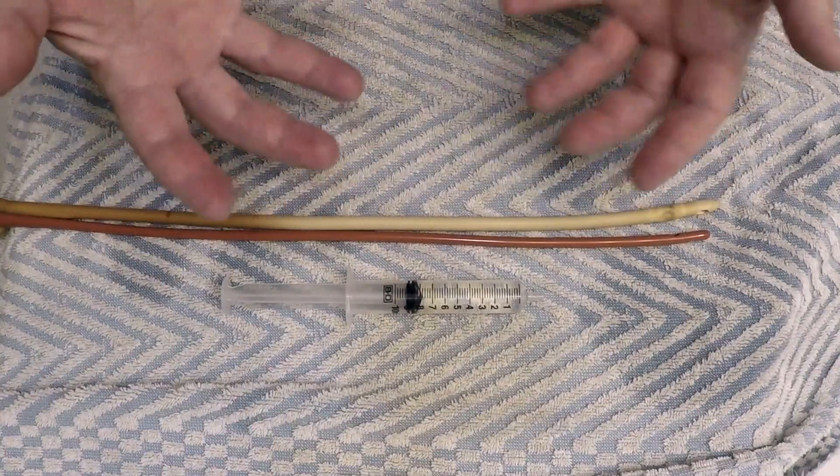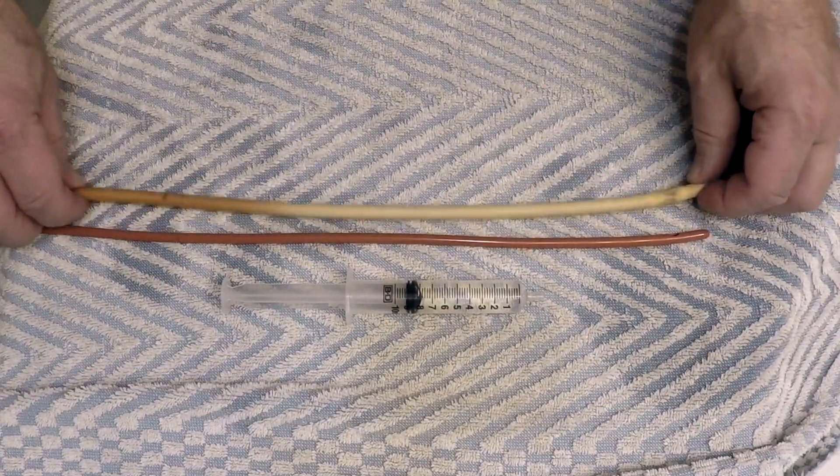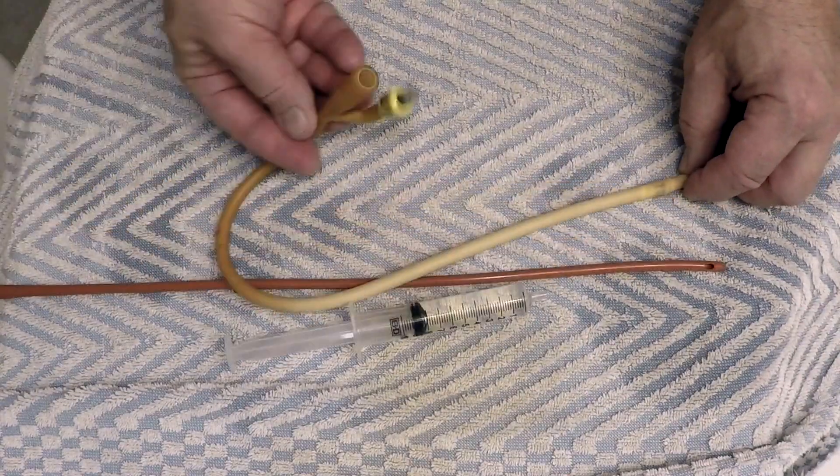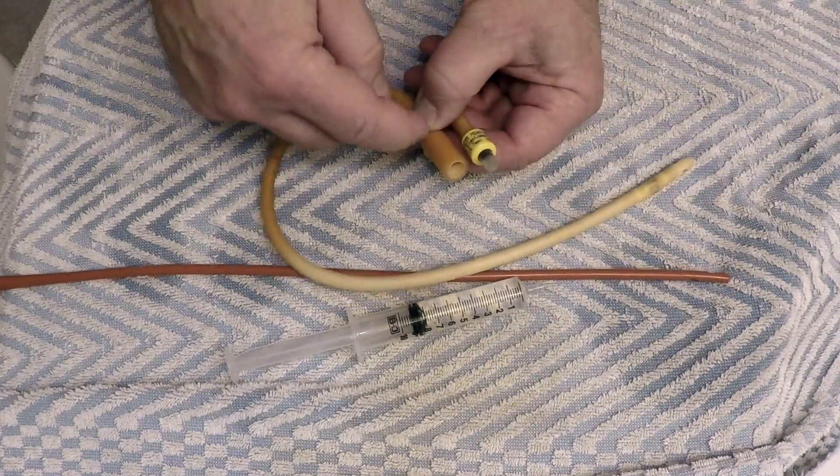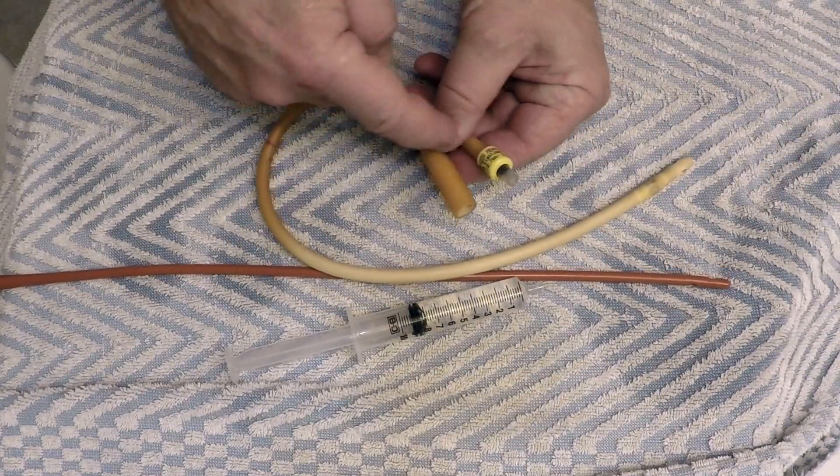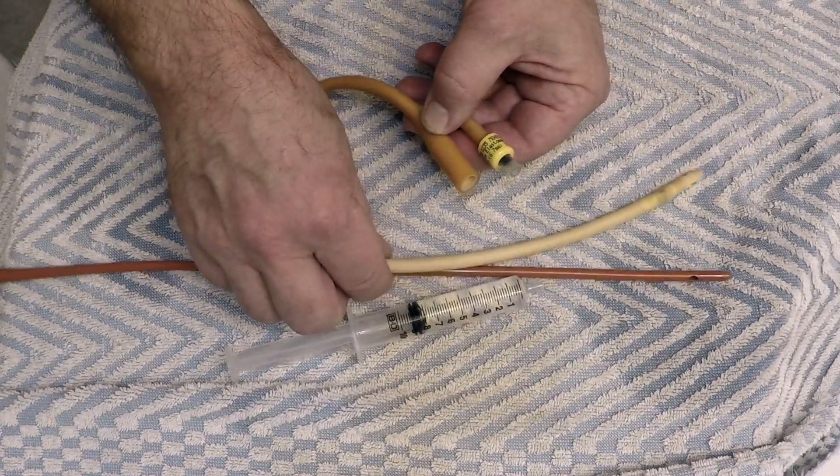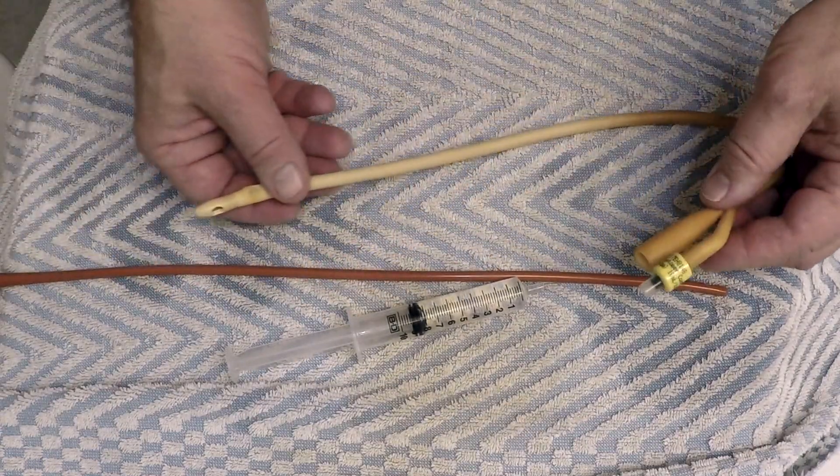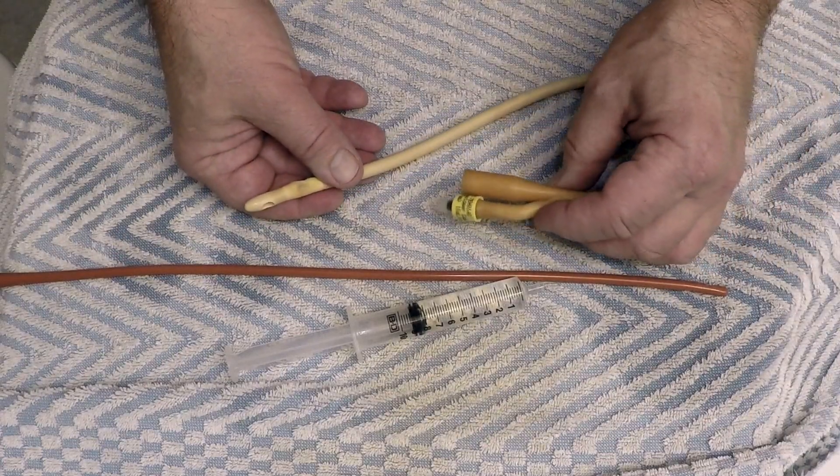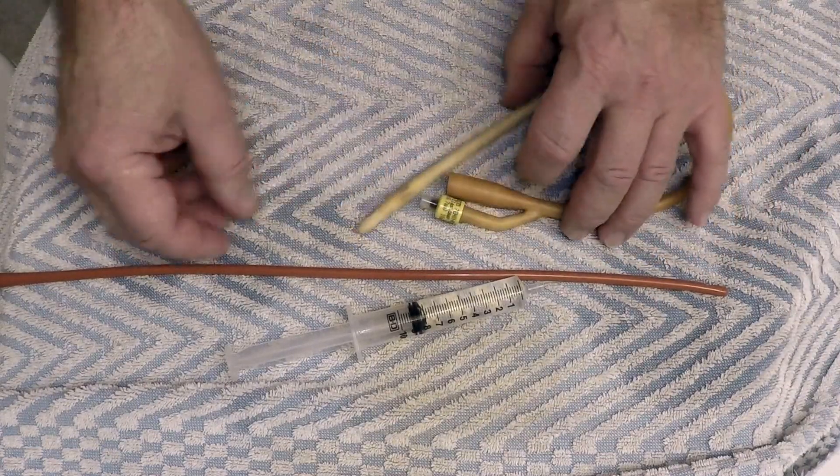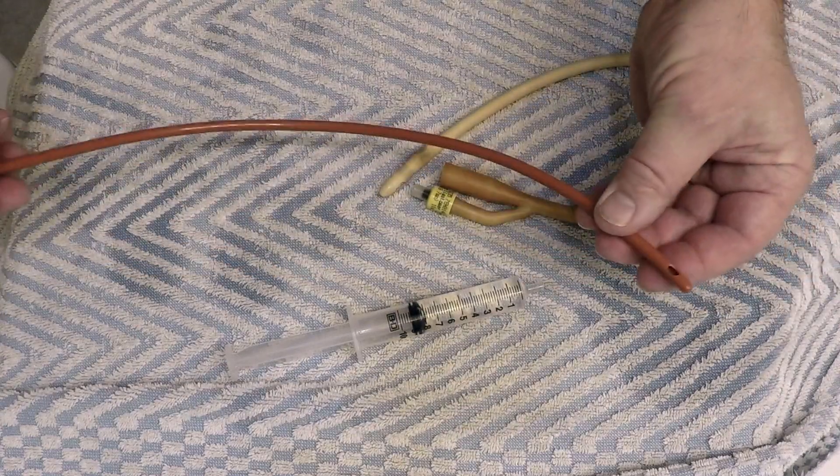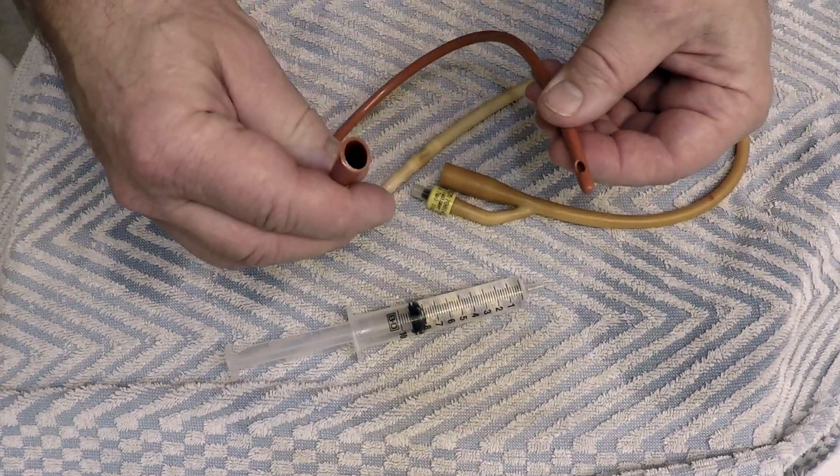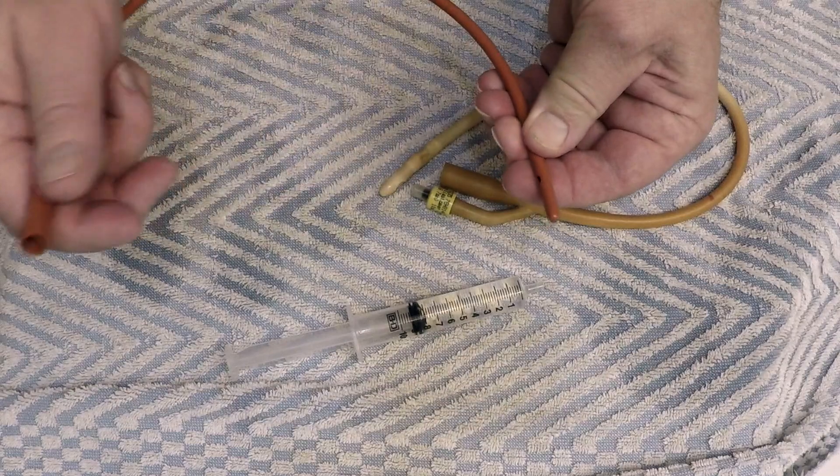So there you have it, the Foley catheter. Foley means that it has two tubes on the inside. One is for draining, and this one is a separate tube that goes all the way to that little bulb. It was invented by a guy named Mr. Foley a hundred years ago or more, probably more.